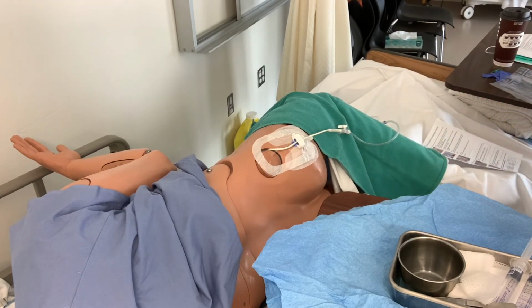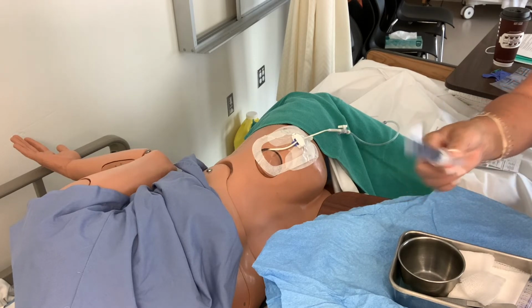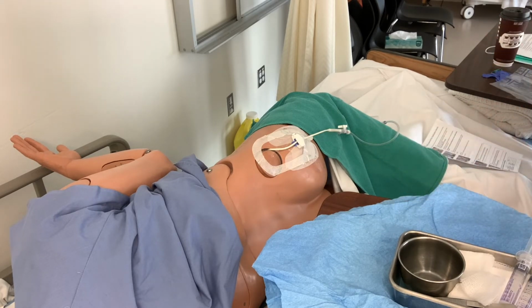I'm now going to add my supplies. So I'm going to add 2 chlorhexidine swab sticks, and I'm going to prime and prep and prepare 2 10 ml saline sterile syringes with the caps off, and I'm going to add them into my tray just like that, okay, so that they're ready to go. I'm now going to add my sterile gloves. I'll put those on, and then we'll get to the flush. So the flush is a real simple part, but it still requires really good sterile technique.